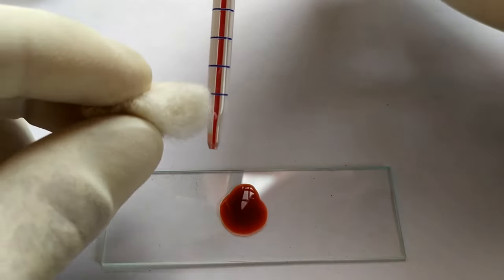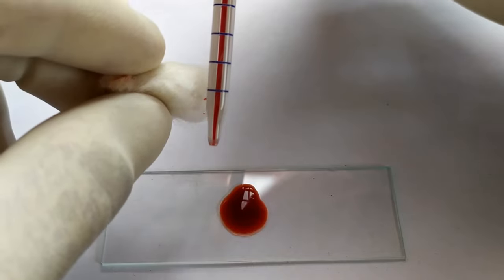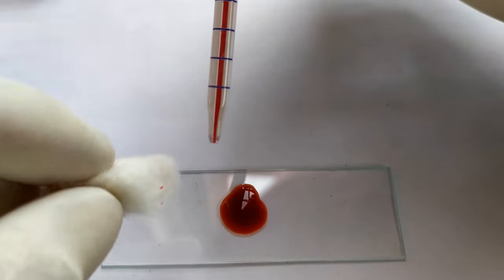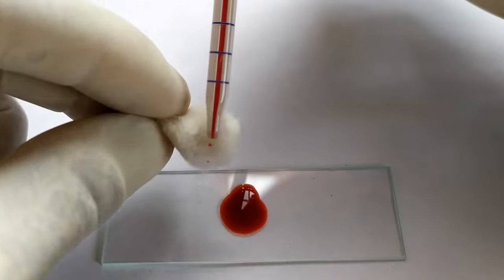Once that's done, carefully clean the excess blood sticking to the outer sides of the tip of the pipette using a cotton soaked in alcohol.